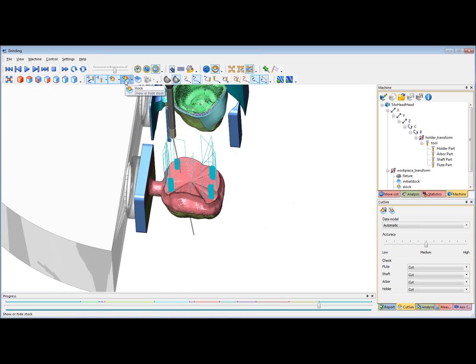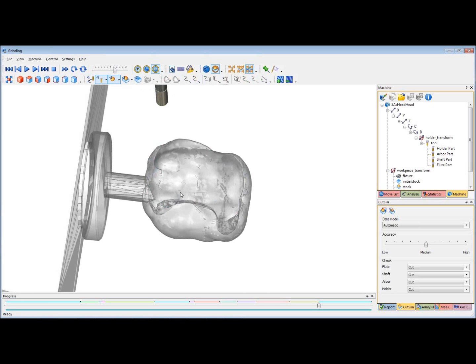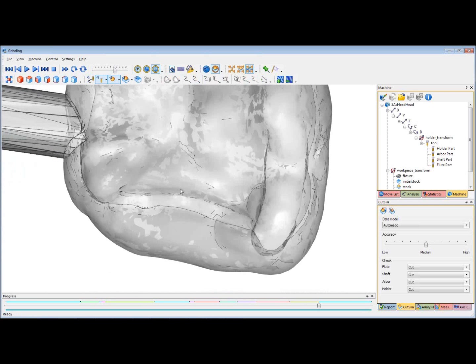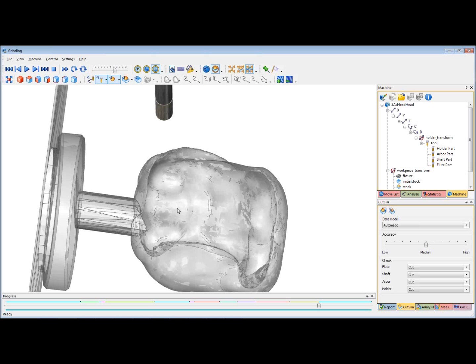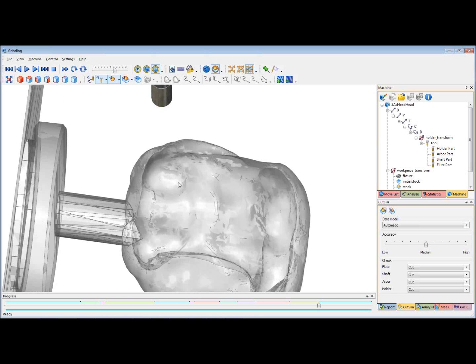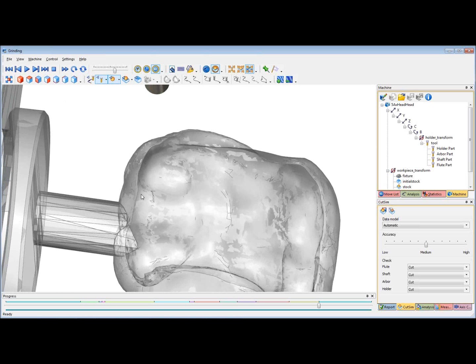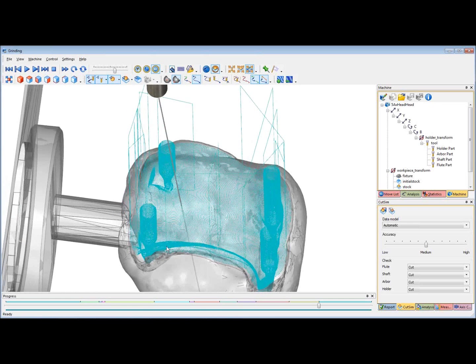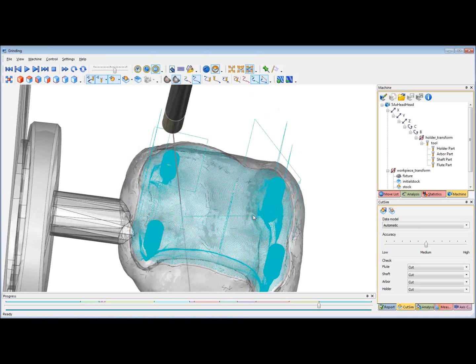For this particular indication, you can see that this has 4 deep cavities, and we can't just ramp into the center and move outwards here, because when the tool plunges into these cavities, it will just burn out. So what we have here is a toolpath where we ramp into the 4 deepest points, and then we have ordering for opening up the 4 pockets.